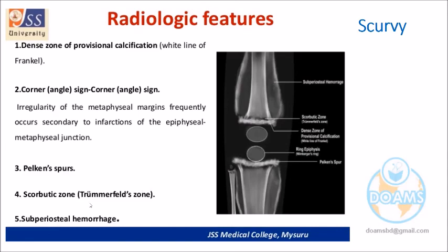Dr. Hind, have you heard all the words before? No. Before today. So try to remember, it is not a very difficult X-ray. Sometimes a pediatric X-ray is given to you.